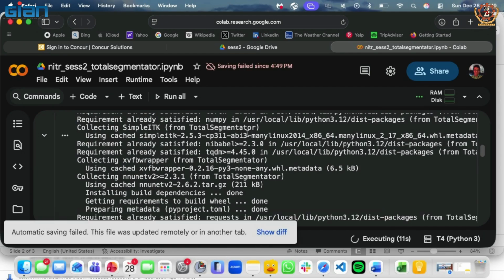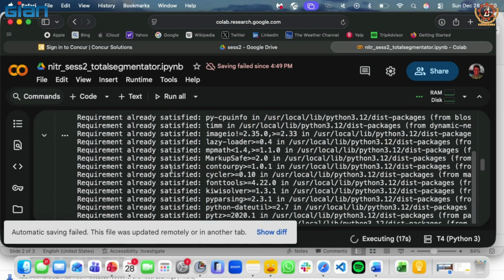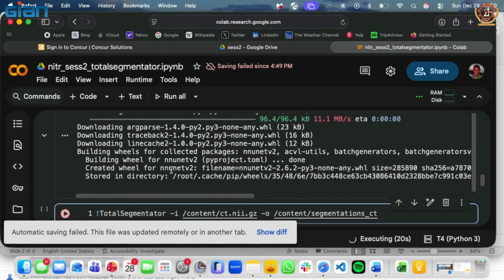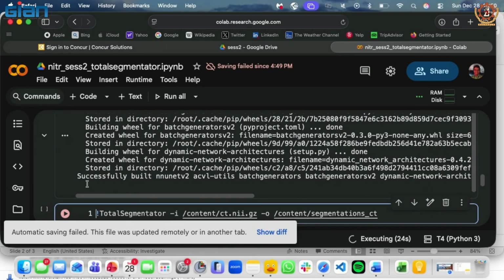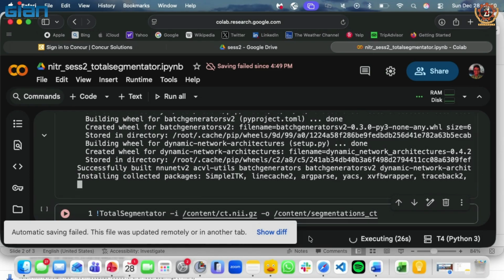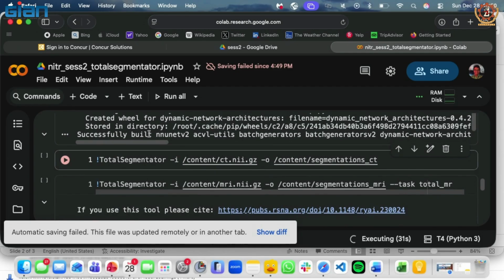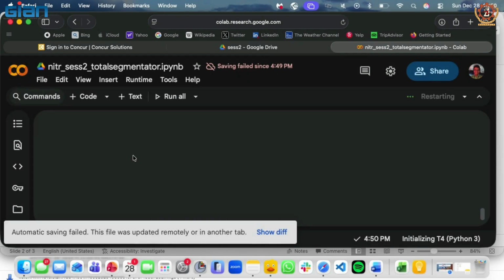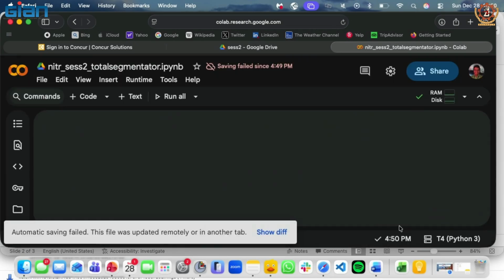Did the CT run finish for you guys? Everyone? Okay. Please wait a few more minutes. I think we can move ahead, okay?